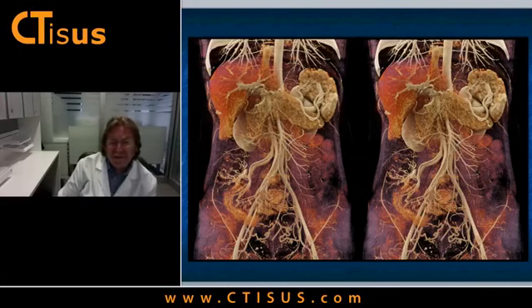A lot of new scanners. I think cinematic rendering is totally dependent on the data. So the better the scanner you have, the better the data, the better the rendering will be. And then, of course, you need to know how to use the scanner well. But the usual thing is, I think it's quality of data. Anything with post-processing is totally dependent on data.